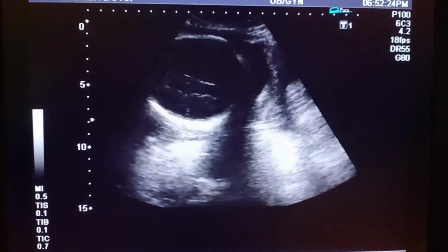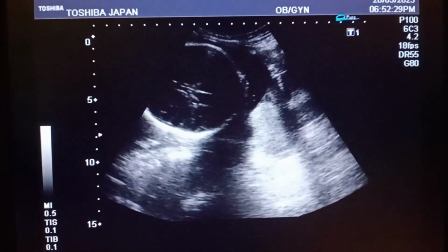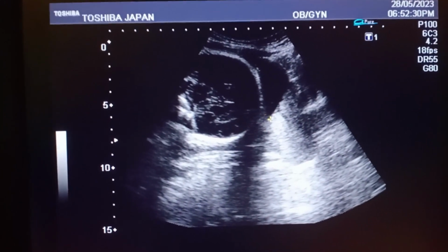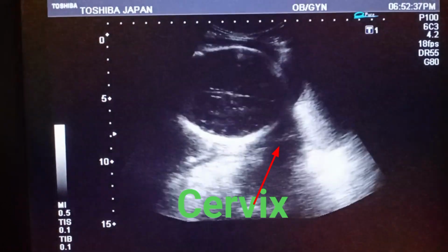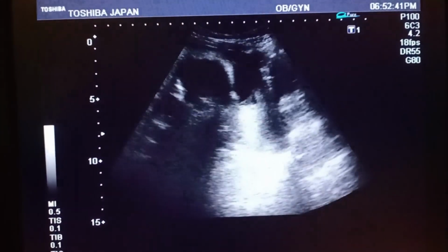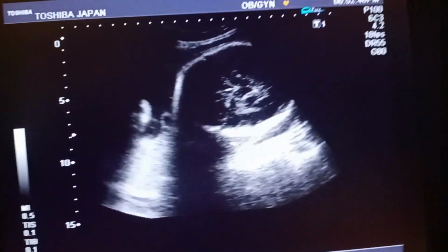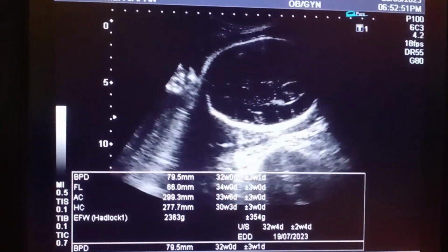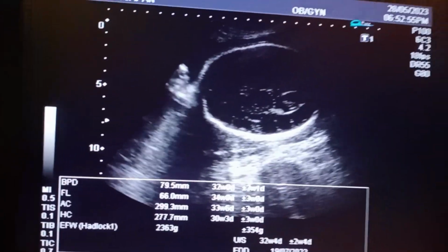female baby. I am going to focus on the cervix, that is just along the head of the baby, because this is a cephalic baby. See the skull of the baby along with the brain.